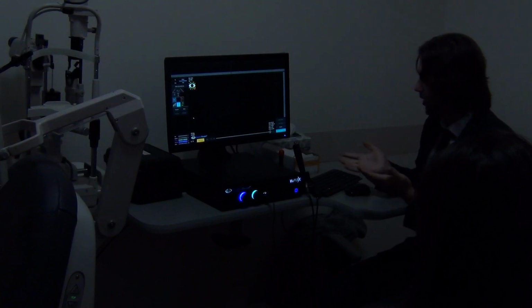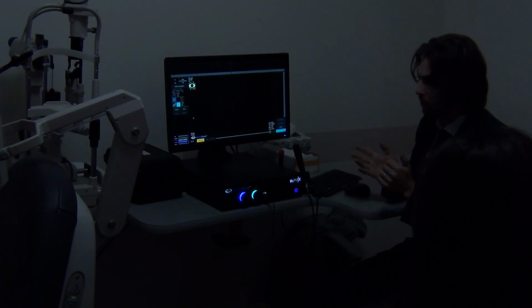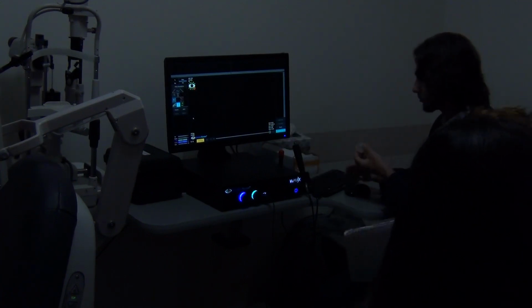Right, so we can actually begin. We need just one patient. Okay. And we'll start the scan. Do you guys mind volunteering? I can. Oh, volunteering, okay.